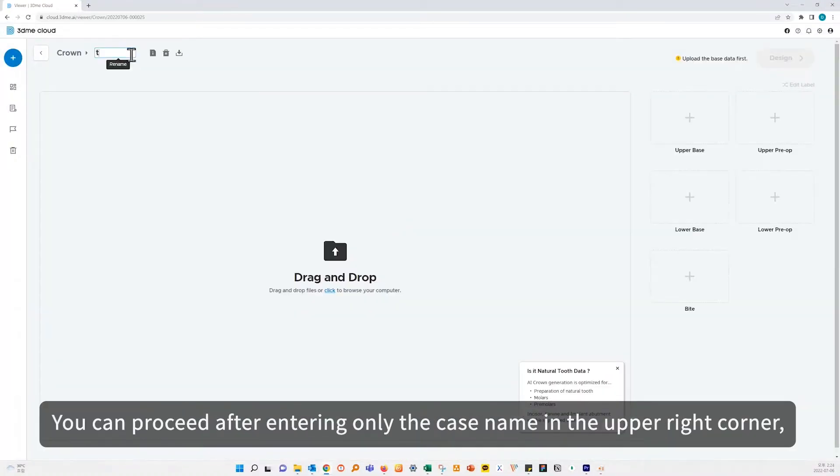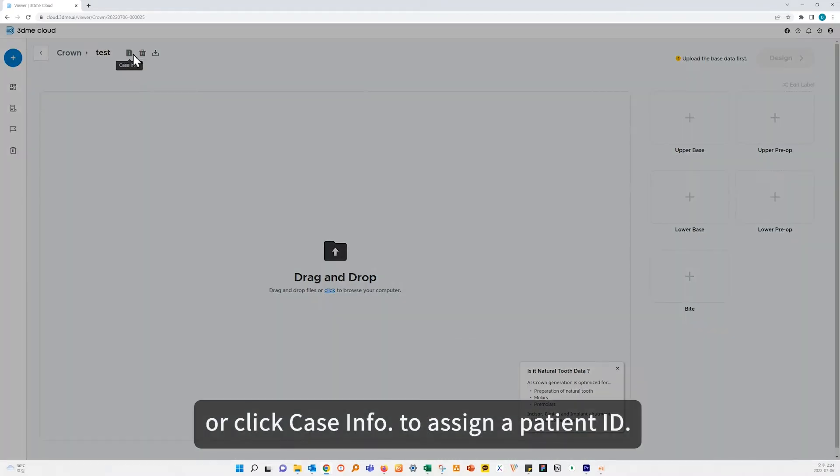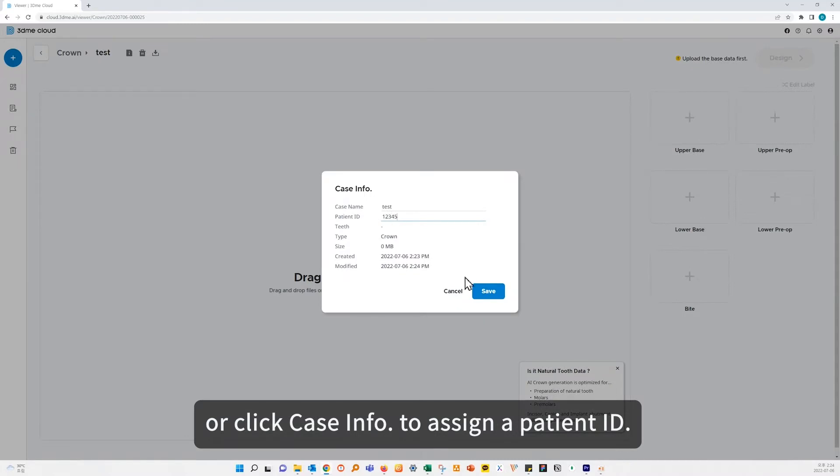You can proceed after entering only the case name in the upper right corner, or click case info to assign a patient ID.